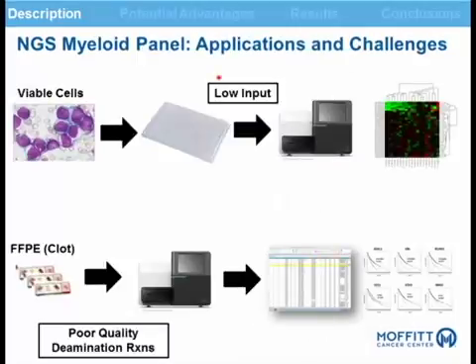So how do we use these NGS myeloid panels in our laboratory? Well, in general we do 2 things. One thing we do is take viable cells, primary patient samples or cell lines, depending on the assays we're doing. We manipulate them in vitro, and then we use, for instance, the ThunderBolts RainDance panel as our readout to understand what occurs after these in vitro stimulations to the composition of these important 49 genes, both the loss of these genes or the enrichment of other genes that we perhaps wouldn't have seen if in vitro manipulation wasn't done.